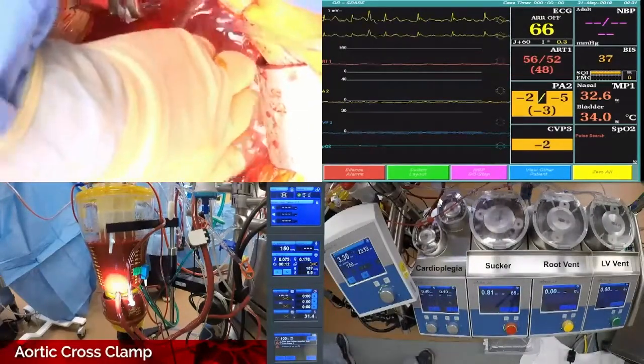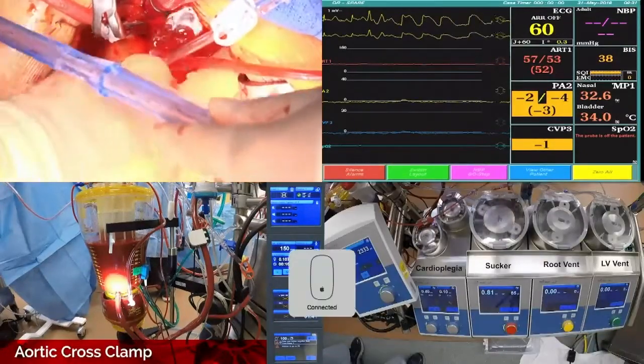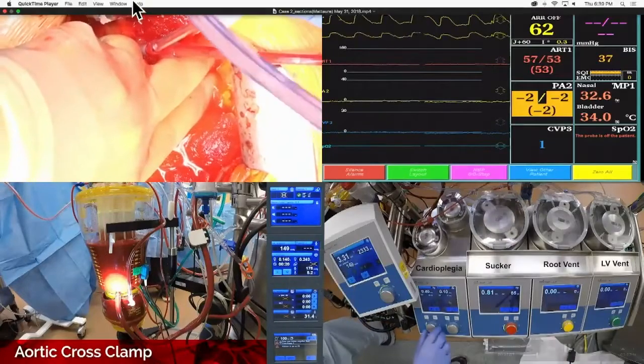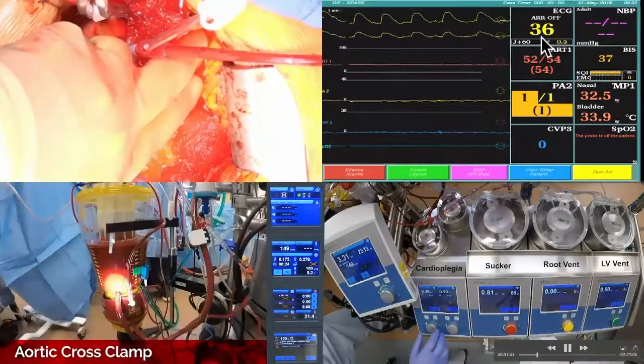You have cardioplegia rolling. You saw the reservoir volume. That is so cool, Patrick. So look at the STs. Wham. That's not working anymore. Okay. There it is, right there. Because you can watch these numbers down here.